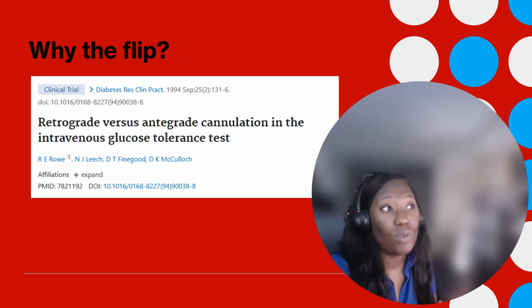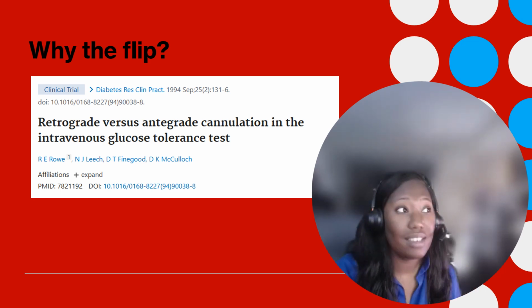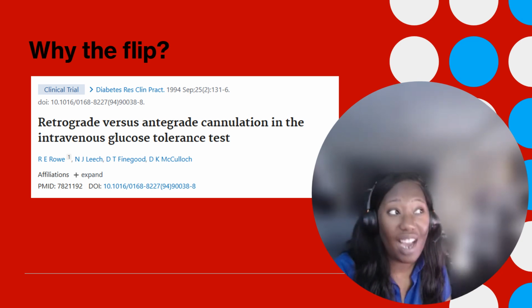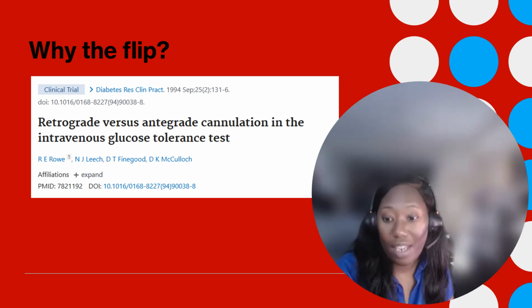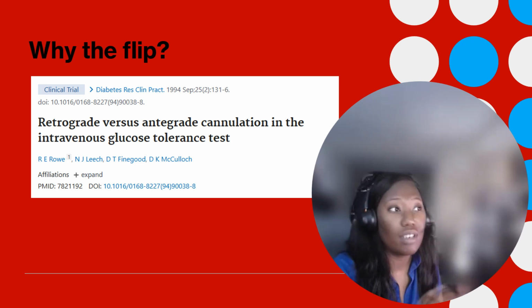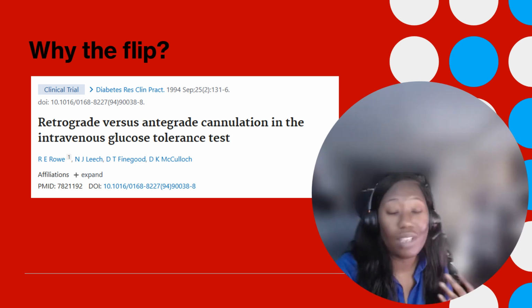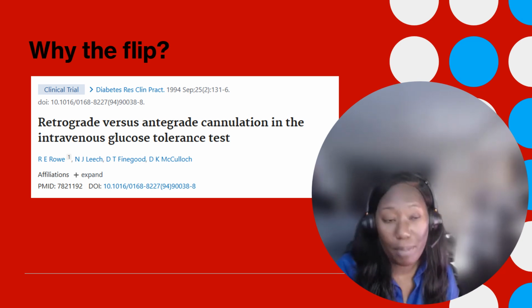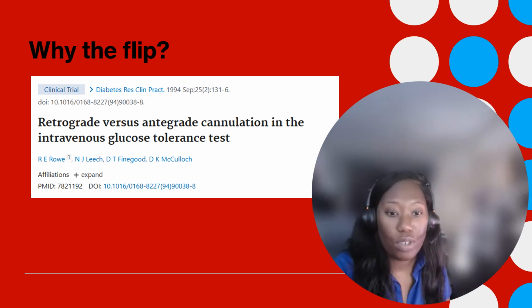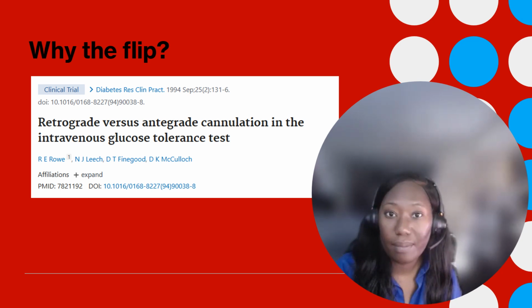They also realized that the hand veins with the retrograde IVs failed at higher rates than the antegrade IVs. And the failure rates, which is just a little fun fact, were particularly higher in female subjects than male subjects. So again, not something that we would use to change practice.